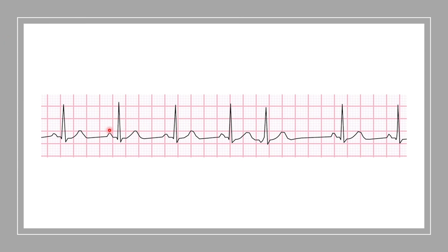We have something similar here: one P wave for every QRS complex, they're upright, the QRS complex is 0.12 seconds or less, and the PR interval is less than 0.2 seconds — so not a first degree heart block. We have what we would consider a sinus rhythm. Measuring from beat to beat, that's about 4.4 boxes, so 300 divided by 4.4 gives a heart rate at 68 beats per minute. But we have a weird abnormality again. We can't see a P wave like in the last one, and we can't see a widened QRS, so we don't think PVC — so this would be a sinus rhythm with a premature junctional complex.